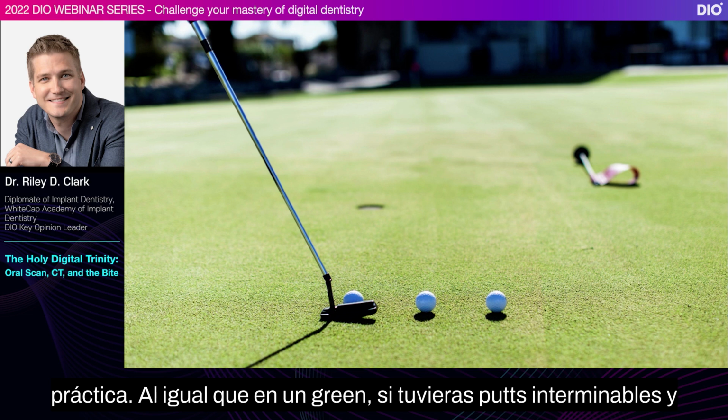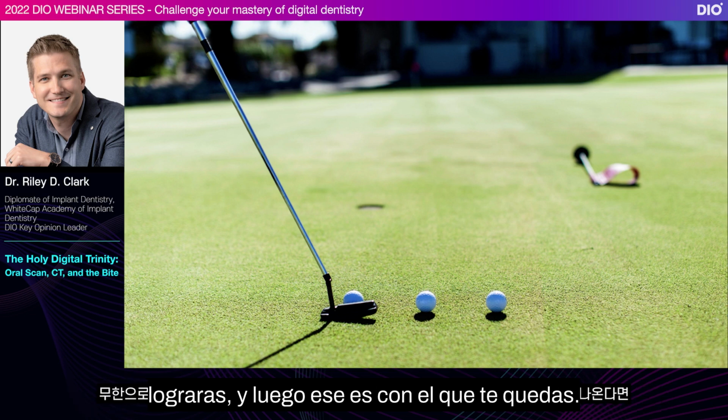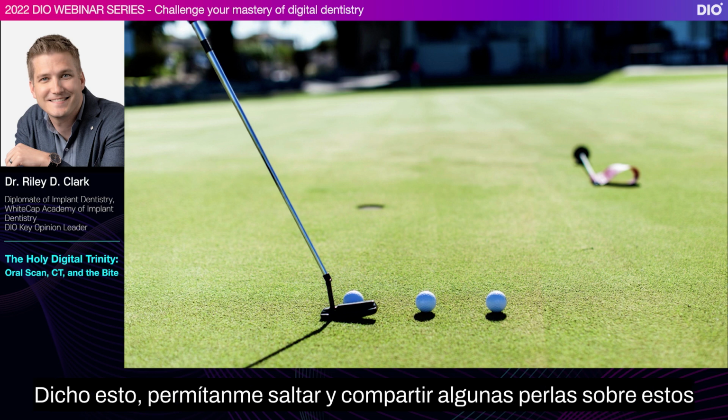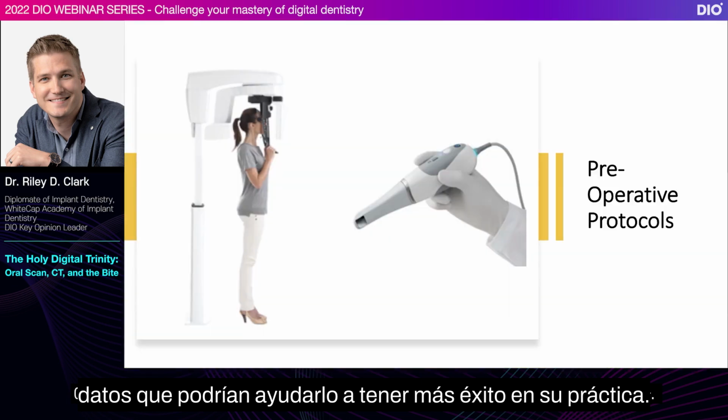And just like on a green, if you had endless putts and you kept getting opportunities to hit a putt until you made it, and then that's the one you stick with, that's what digital workflows represent. And that's what these data sets give us an opportunity to do. So with that said, let me jump in and share some pearls about this data that might help you be more successful in your practice.